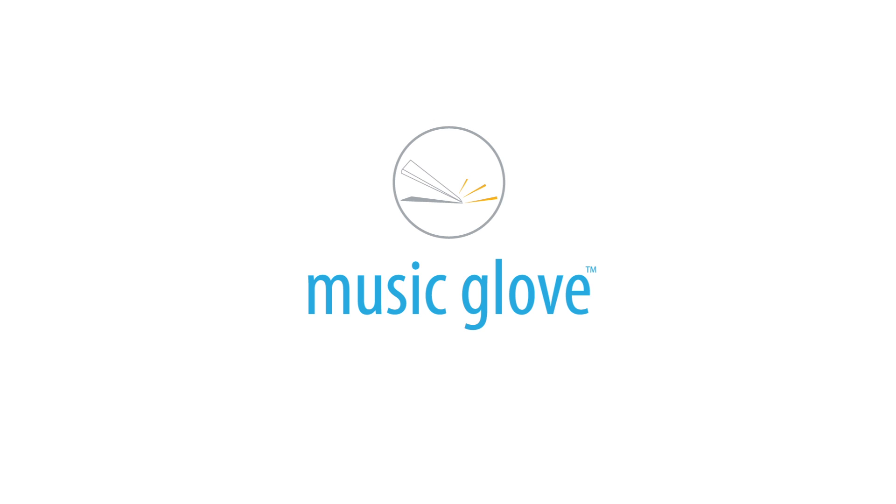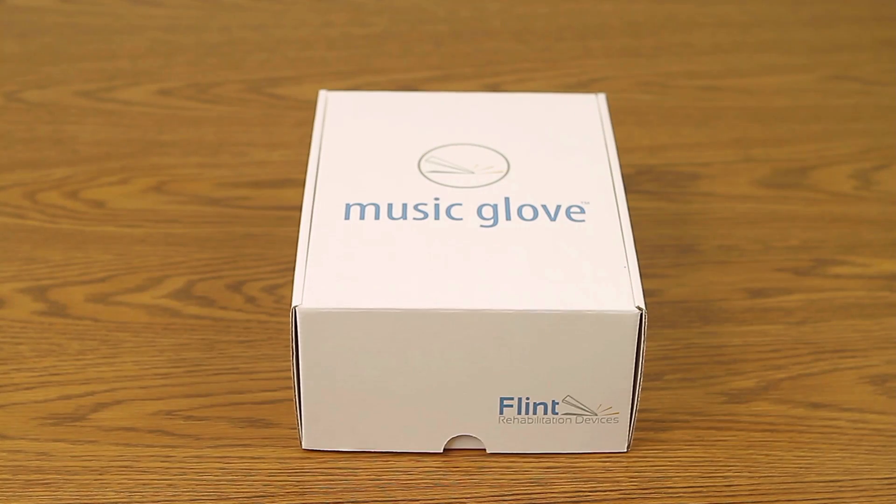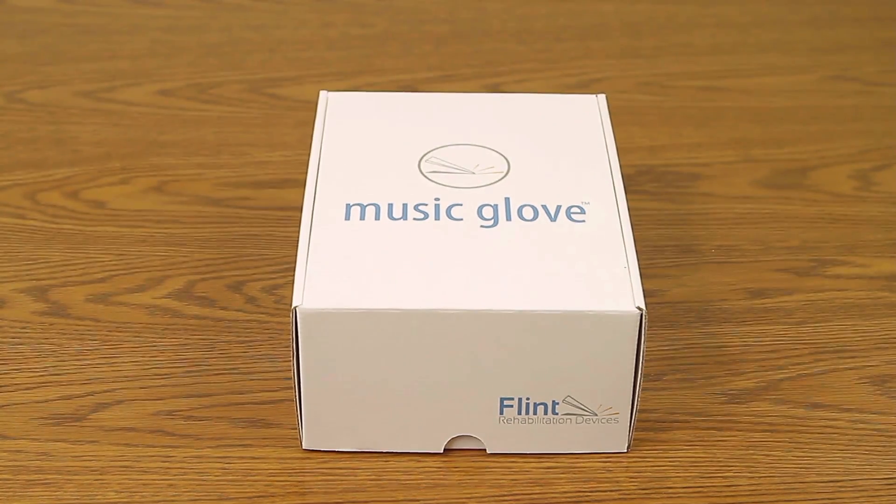This instructional video will walk you through how to properly set up and use the MusicGlove Home Suite. To get started, open the MusicGlove box and remove all the contents.